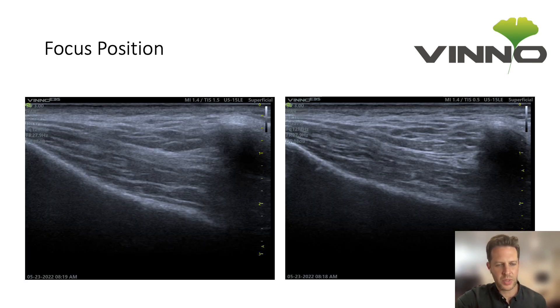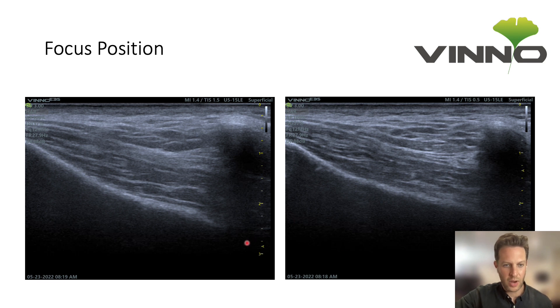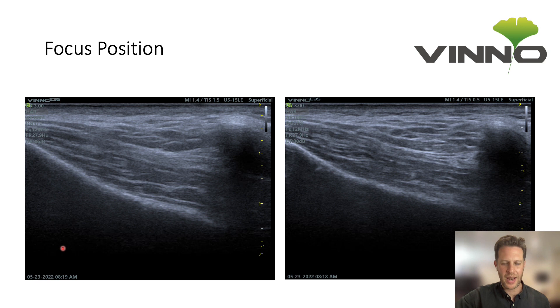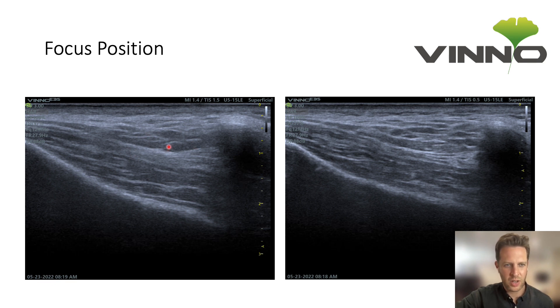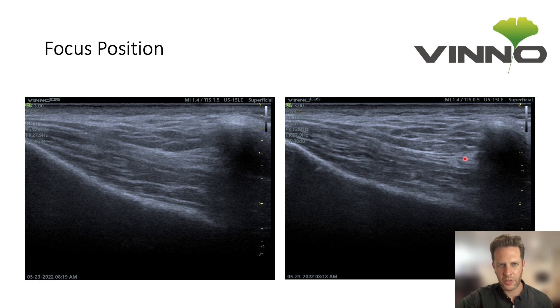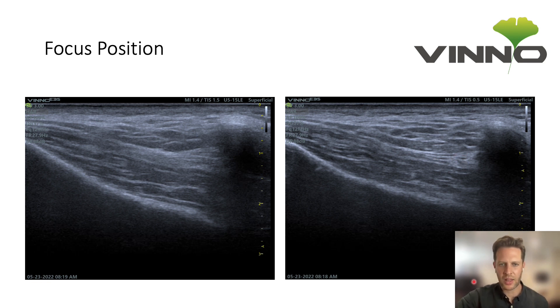Next we can optimize the focus position. Some machines now have automatic focus, but essentially the focus position is the point where the ultrasound machine narrows the beam to its narrowest point. On the left, the focus arrow is too low — below the level of the bone — so the deep temporal fascia and superficial fat pad are not clearly defined. On the right, with the focus position about midway, you can clearly see all the detail within the deep temporal fascia and the fat pad.